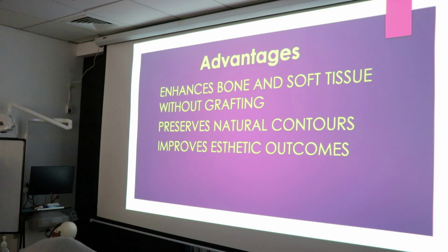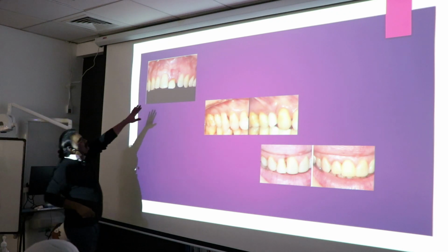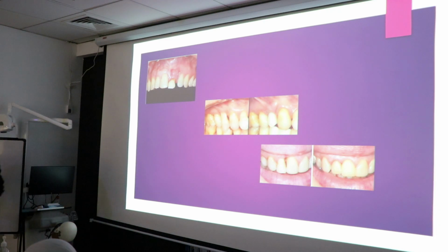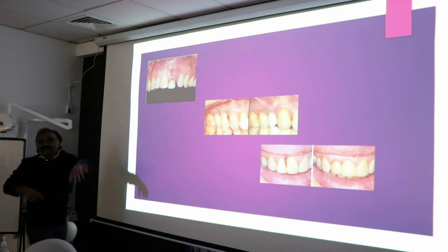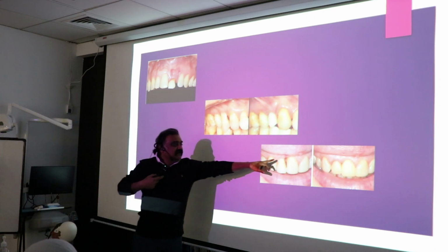Dr. Sundar, go back to the clinical that you skipped. Let's see what they have done. Yeah, leave that on for a few seconds. So they are looking at 2-1, is it? This one. It's a deciduous tooth. They're trying to, what is it? This one here as such. Yeah, it's a deciduous tooth. No, it was fractured, doc. Okay, actually, sorry, this was a composite that was added to make it long. Sorry. That's actually not a tooth. Okay, not a tooth. And this was just shown for that particular issue which you had.